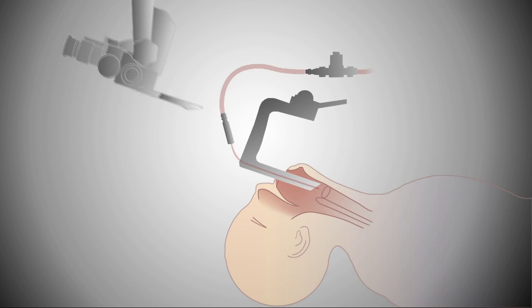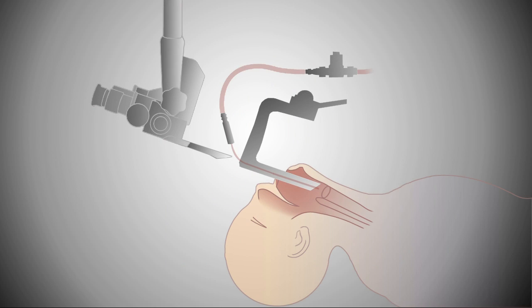Your exposure per line of sight limitations can oftentimes be a problem. In other words, you may see the stenosis straight on, but it may be hard to actually see the corners of that stenosis and the inferior aspects of that stenotic area.